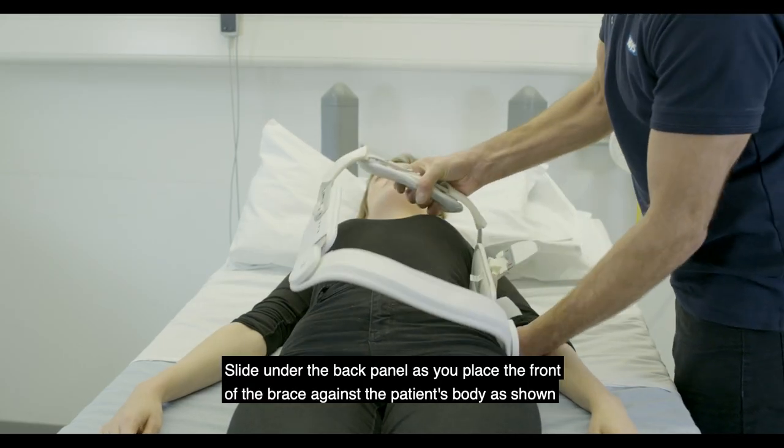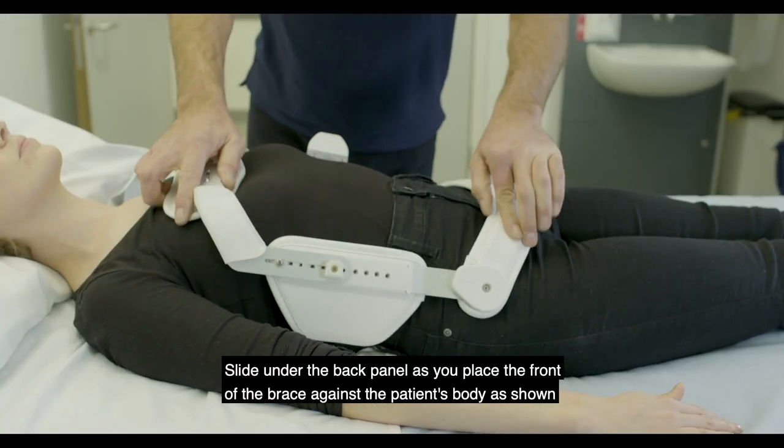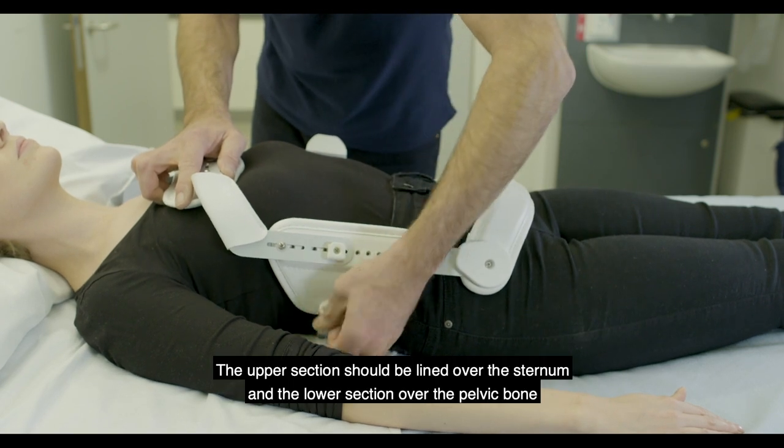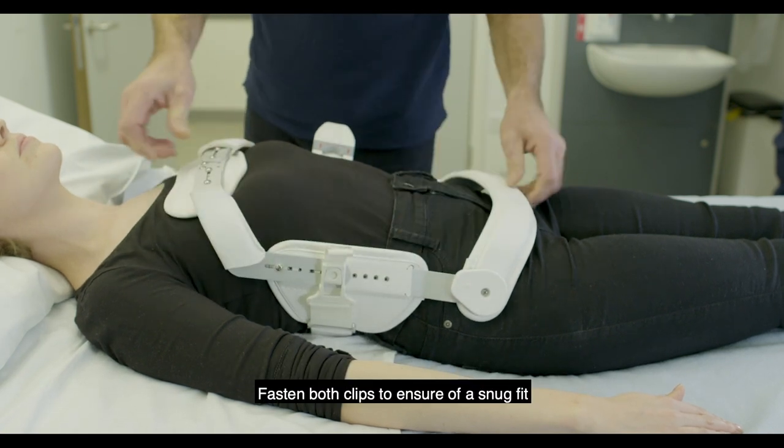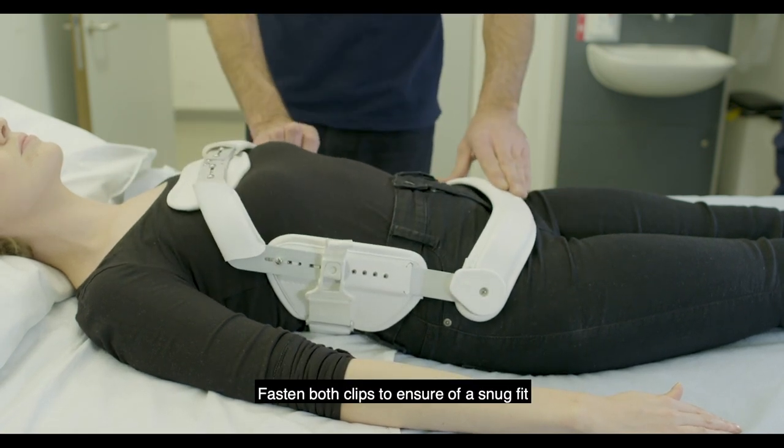Slide under the back panel as you place the front of the brace against the patient's body as shown. The upper section should be aligned over the sternum and the lower section over the pelvic bone. Fasten both clips to ensure a snug fit.